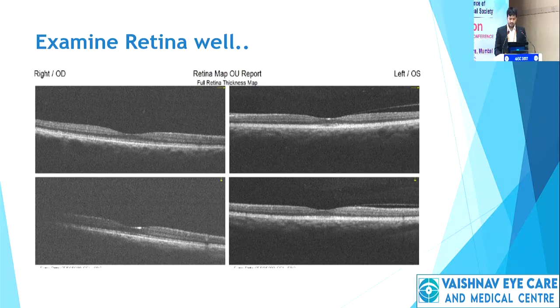You need to screen the retina well. You have to be sure about the macula, so get a macular OCT done. My patient had a pretty decent foveal contour, so I went on to the next step, that is the surgery.